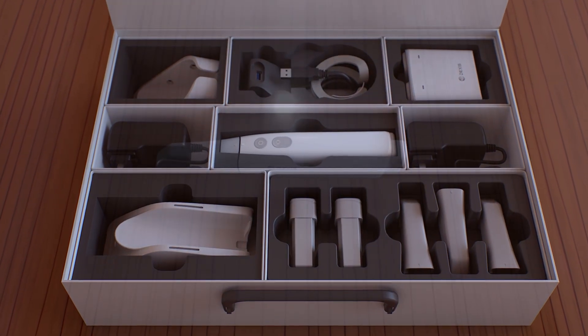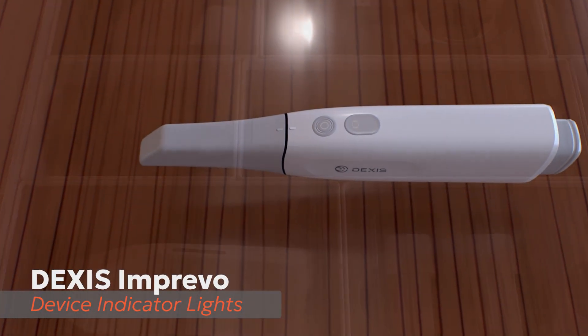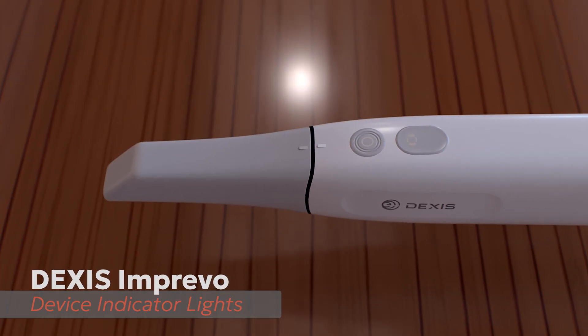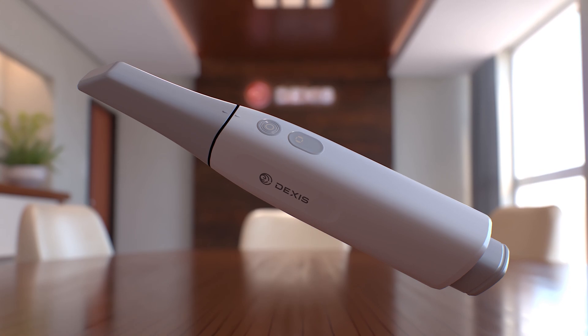Utilizing the dynamic LEDs in the handpiece, the Imprevo allows the user to quickly see the status of the scanner and the scanning process. The LED displays various colors and on-off patterns to indicate different scanner statuses such as scanning, battery status, and fault indication.